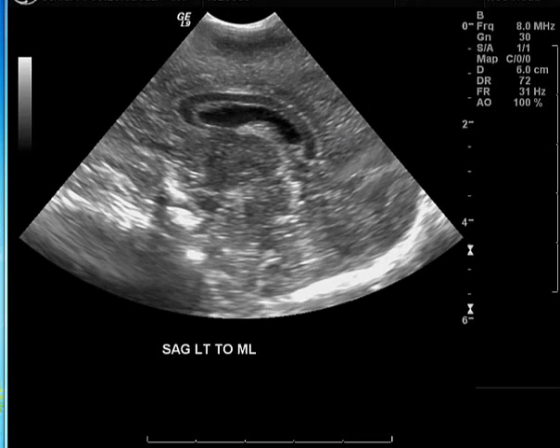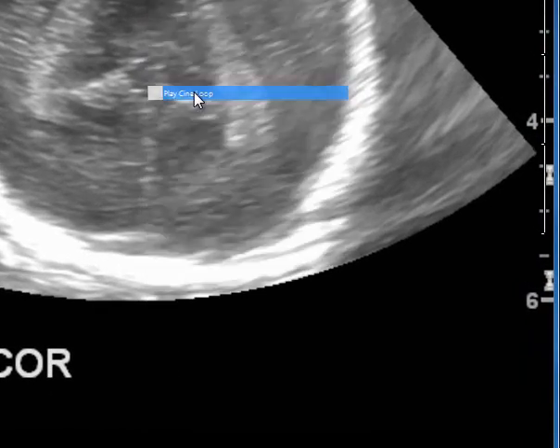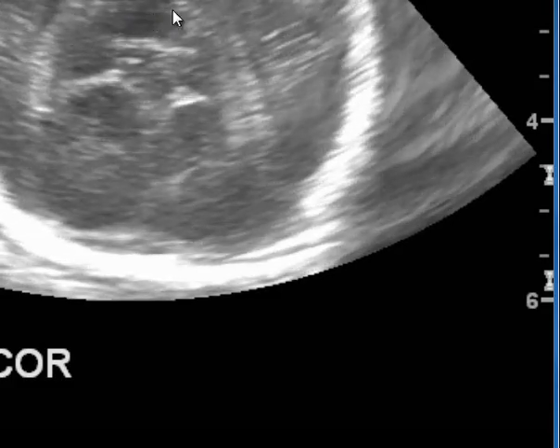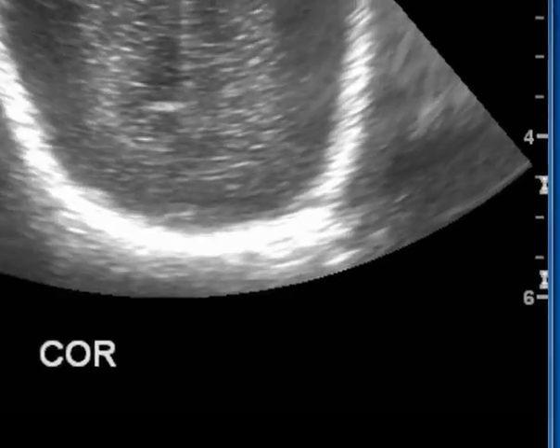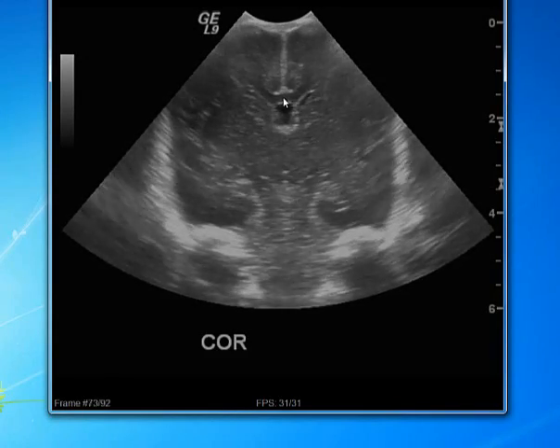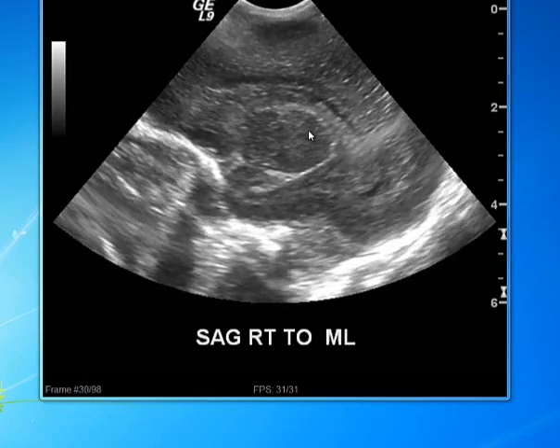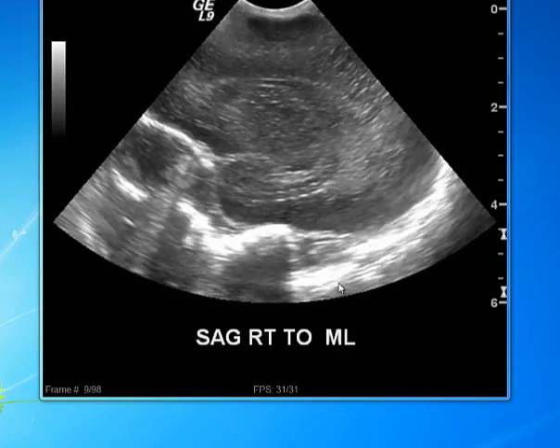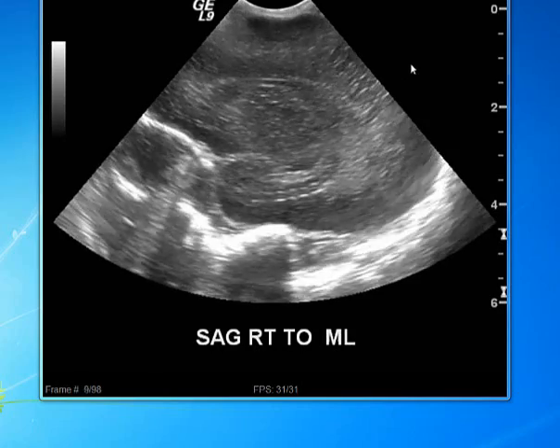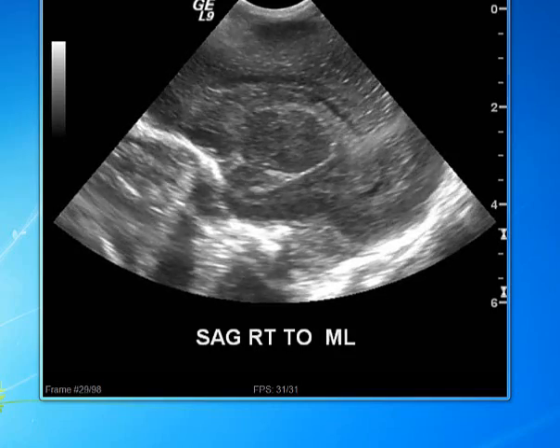In addition to static images, we also acquire cine images — video loops of the same planes I just showed you. You can see the posterior coronal portion of the brain on a cine image, followed by the anterior coronal cine image starting from the front going to the midline. Similarly, cine images are obtained in the sagittal planes: right to midline and left to midline in cine format. That, in a nutshell, is an ultrasound of the brain — also known as an echoencephalogram — performed in a premature baby.